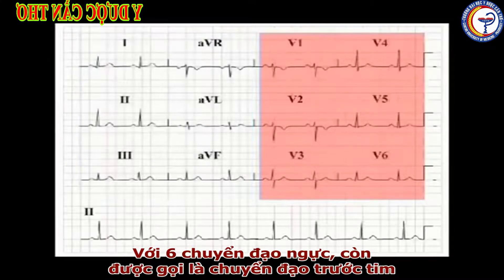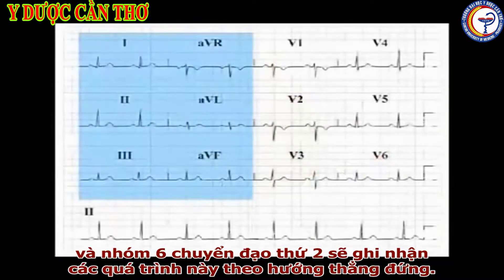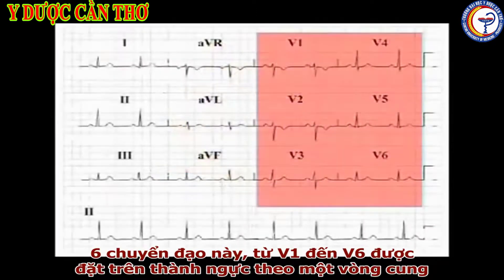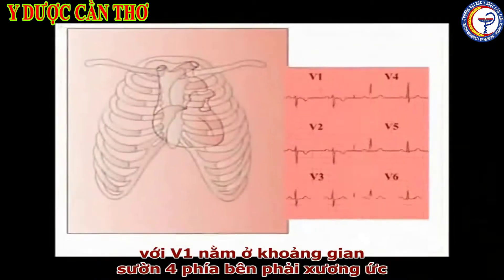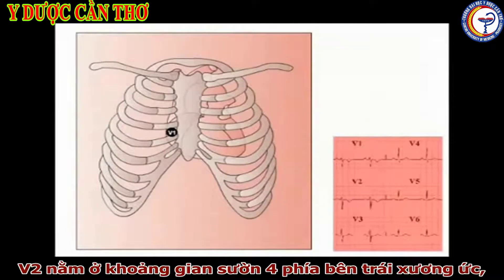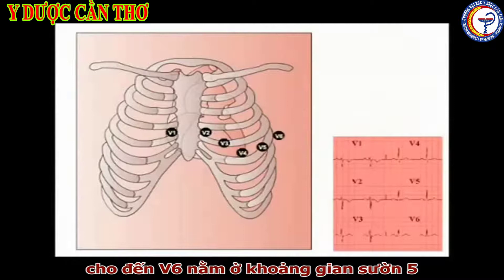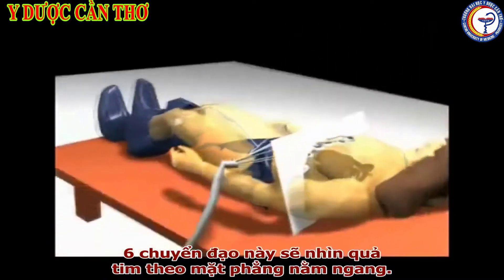The six chest leads, also referred to as the precordial leads, examine the heart in the horizontal plane, while a second group of six leads examine the heart in the vertical plane. We will first deal with the precordial or chest leads. These six leads, V1 to V6, are placed on the surface of the chest wall in an arc, from V1 in the 4th right intercostal space to the right of the sternum, to V2 in the 4th left intercostal space to the left of the sternum, and then at roughly equal intervals to V6 in the 5th left intercostal space in the mid-axillary line.